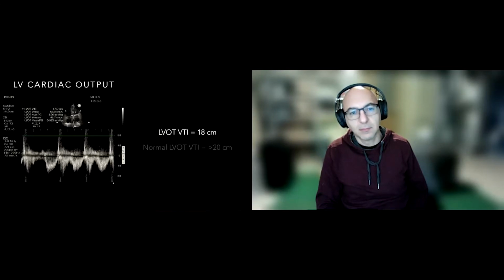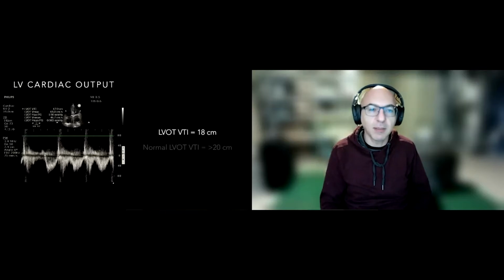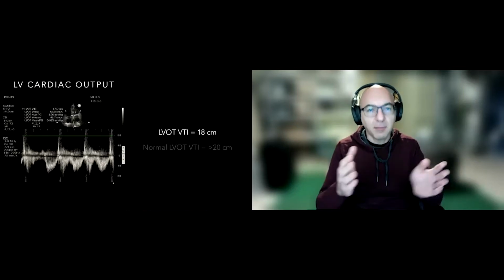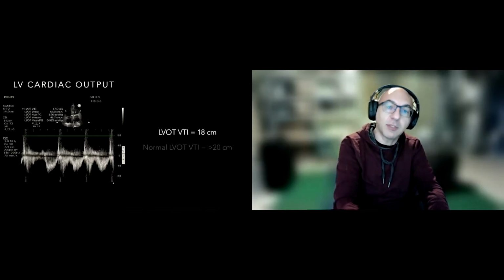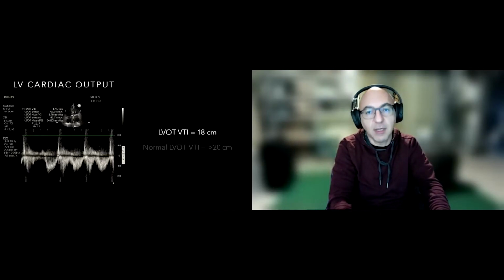So I don't know, Z, did you want to weigh in with any thoughts about the VTI? I know we talked about it a little bit earlier, but the VTI versus ejection fraction assessment. Oh, definitely. You get a patient who is hypoperfused. Maybe this person wasn't hypoperfused yet, but eventually they will probably become. So you get a person who's hypoperfused, you look at the heart, and let's start with good ejection fraction. Now you want to know, is this ejection fraction really going through the LVOT? And is it pushing enough volume of blood? I would say go for the VTI and measure it.